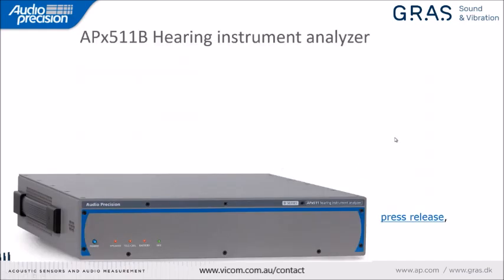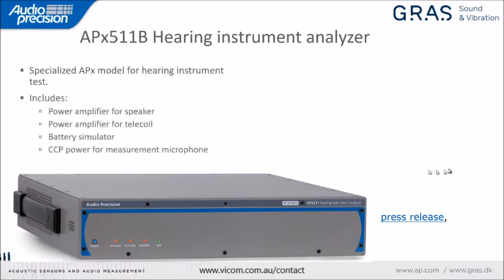Next, this is the analyzer that I'm using today. It's our APx511 hearing instrument analyzer. I don't have the B series version. I have the legacy one, but it's functionally the same. It's a specialized APx model for hearing instrument test, and it has built-in accessories: a power amplifier for the loudspeaker, a power amplifier for the telecoil. That is, you specify the level for the coil in terms of amps or milliamps. It has the built-in battery simulator to power the hearing aid battery and to measure the current. And it has CCP power to power the measurement microphone.